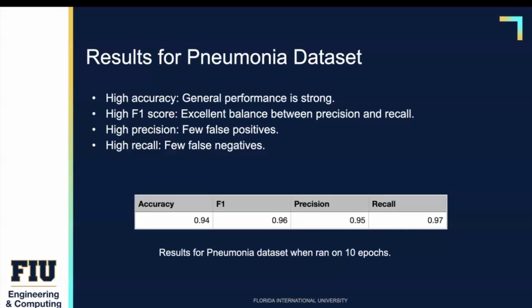Overall, these results show that our model is highly effective at diagnosing pneumonia, with excellent performance across all key metrics. This level of accuracy, precision, and recall means that our model can be a reliable tool for supporting healthcare professionals in identifying pneumonia cases, ultimately improving patient outcomes.